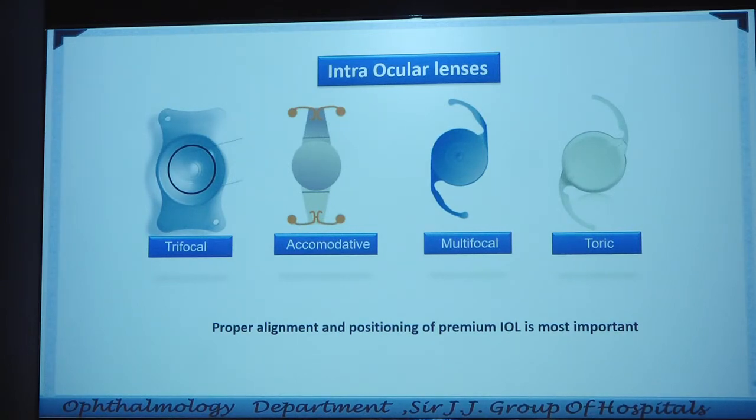What is required there is the rhexis. Rhexis is important, incision is not important, always remember. So if you are putting a multifocal in SICS, you are not an inferior surgeon. You are a surgeon who has thought of the patient, thought of your skill, thought of the lens, and removed the cataract. So that is what is required.